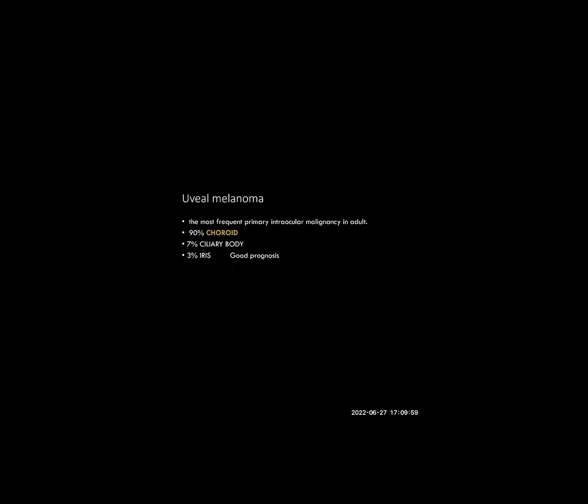First pathology is the uveal melanoma. Melanoma is a disease which can come everywhere, in a very odd region, and it metastasizes everywhere. The good sign in the melanoma is that in the CT, it is a bit hyperdense. So it is a bit characteristic. It is not exclusive, but a bit characteristic.